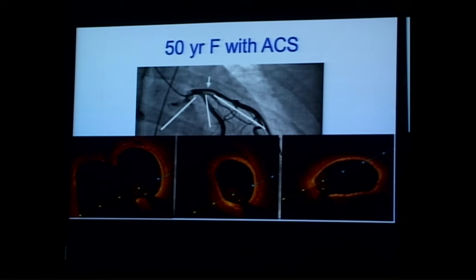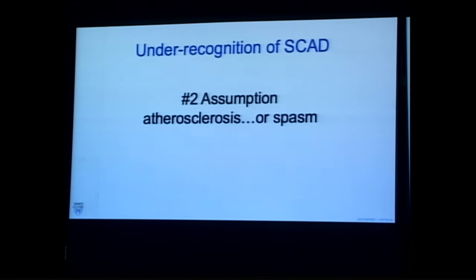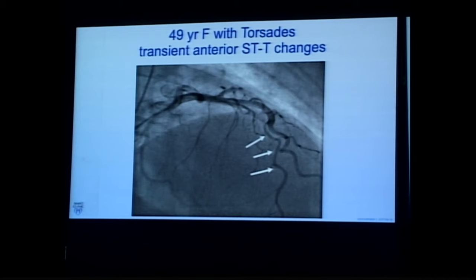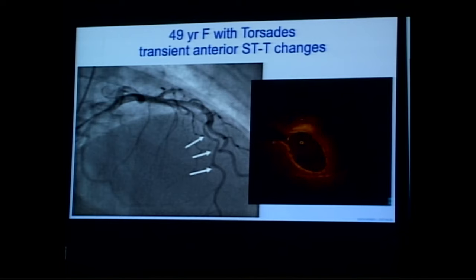A second reason for misrecognition of SCAD is we call things spasm. Here's a patient with transient ST changes and torsades de pointes, with a diffusely narrowed LAD that we might have called normal or spasm. But evaluating with OCT, we see again a huge collection of intramural hematoma causing a compressive, diffuse narrowing of the LAD.